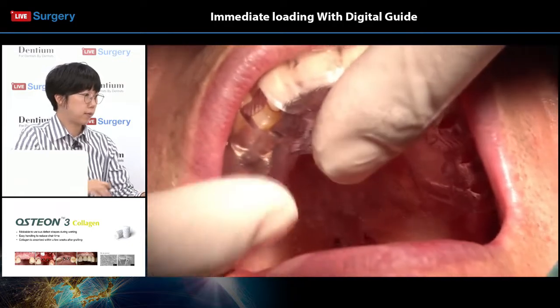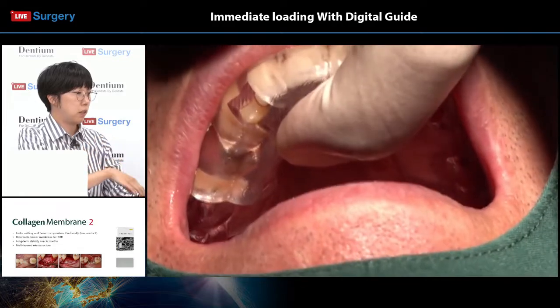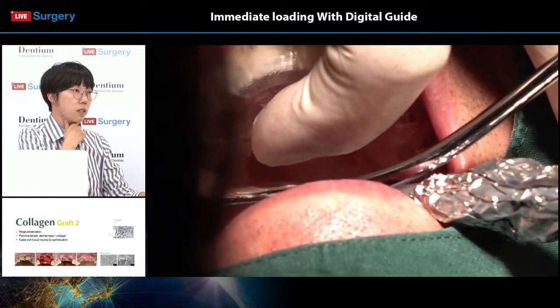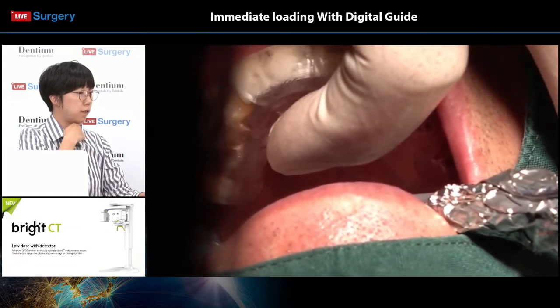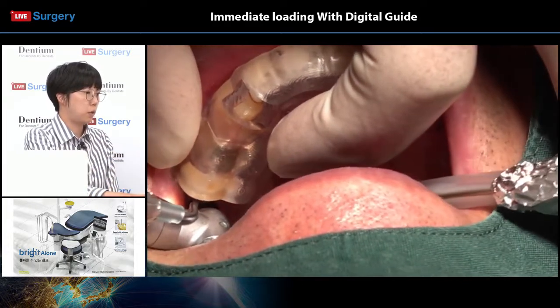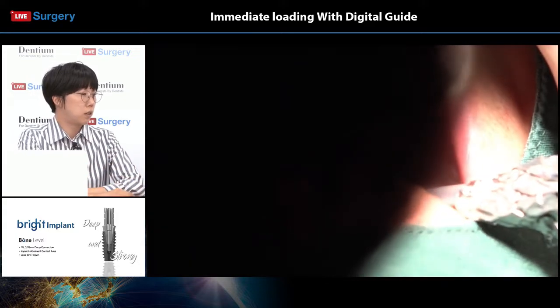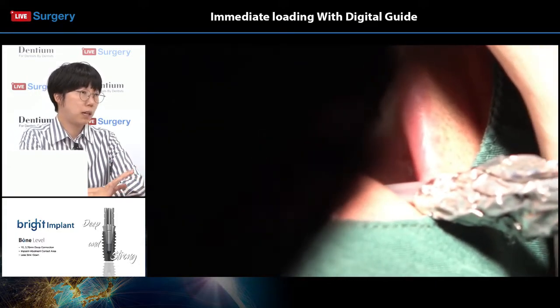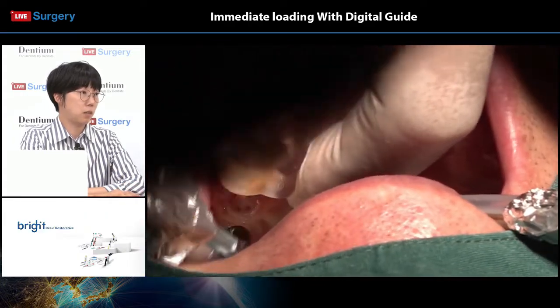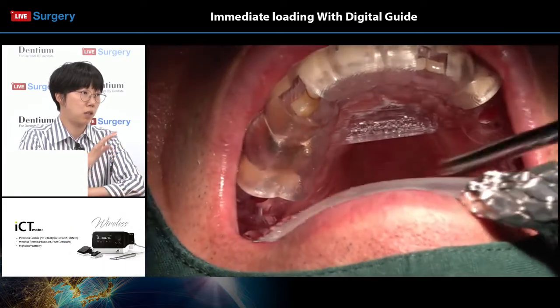Okay, usually the digital guide system accommodates up to 5.0 diameter because as long as there is enough bone, a 5.0 diameter implant is chosen as a gold standard in most posterior cases. But it's always safe, when planning a digital case, that your guide matches the implant system that you're using and accommodates up to the diameter that you're planning to use.